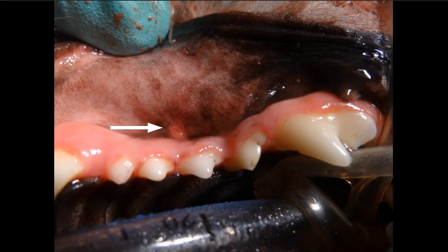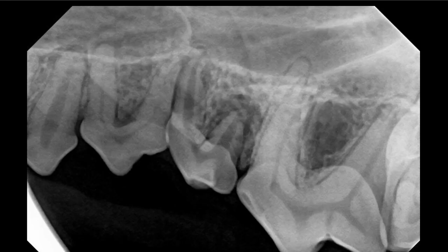So take a look at this radiograph of the exact same patient. What do you see there? Pretty obvious, huh? You've got a really large pulp cavity diameter in that tooth as opposed to the pulp cavity diameter in the other teeth. You do have a large pulp cavity diameter in that first premolar there as well. And if you look around that root tip, you possibly have a lucency there as well that would indicate that that tooth is non-vital. But anytime or almost every time that you see that increase in pulp cavity diameter, that tooth is non-vital, and the recommendation is either root canal or extraction.